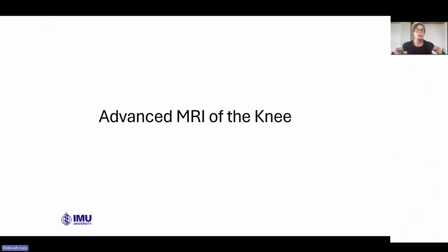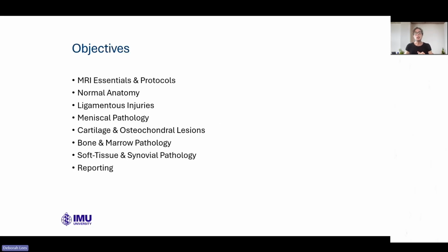Okay, so let's make a start. So advanced MRI of the knee. So let's go. Okay, so essentially today I want to cover some of the MRI essentials and protocols. It's stuff that you should be familiar with. There's nothing new on here.